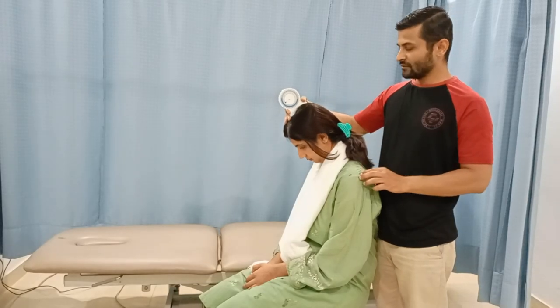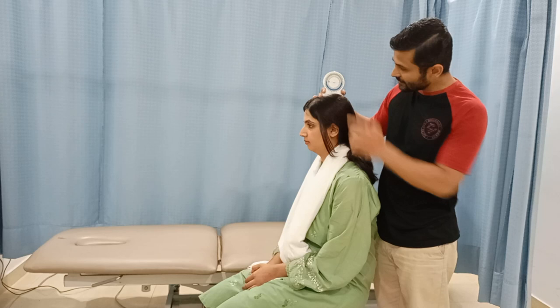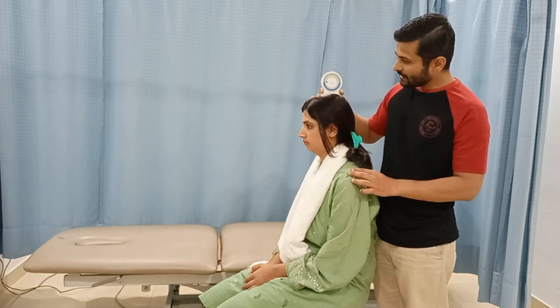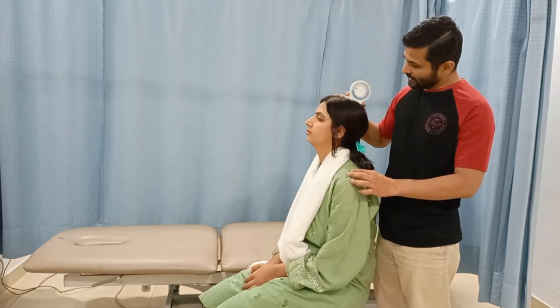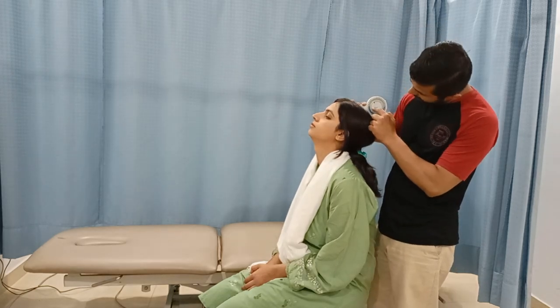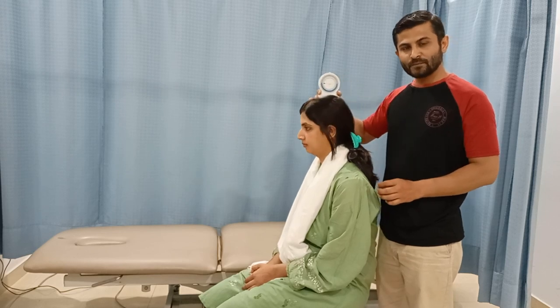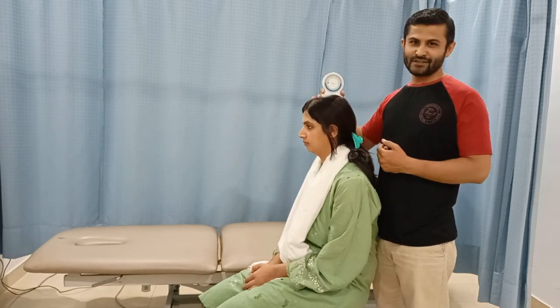Now the patient returns to the neutral position, which is about zero degrees, and from here we perform the movement of extension all the way. Looking at the inner scale, that is about 55 degrees. This is the active range of motion for flexion and extension.